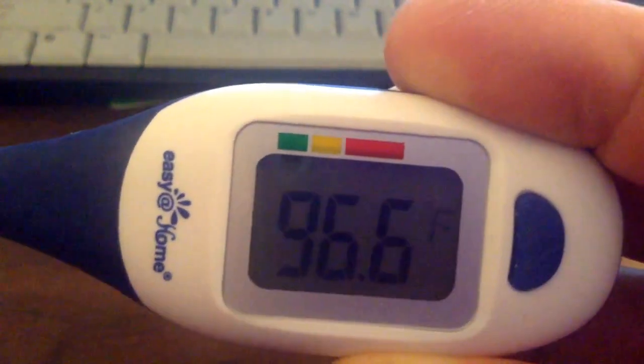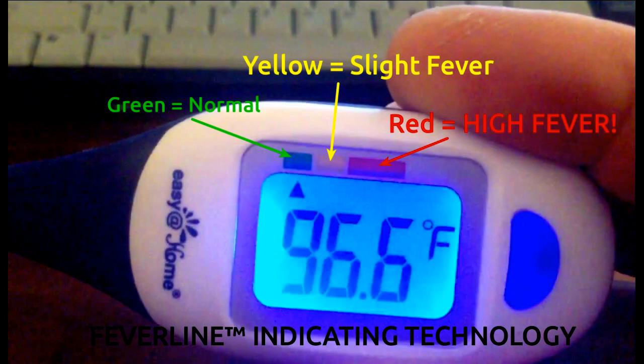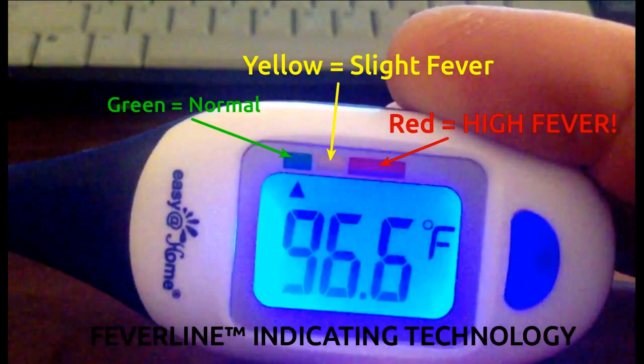One feature I like is the color-coded fever line above the LCD display. I don't have to know what temperature is of concern. A triangular arrow indicates after each reading whether the result means normal — green, low fever — yellow, or high fever — red.